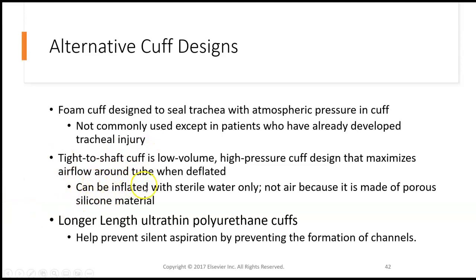These tight to shaft cuffs typically have to be inflated only with sterile water and not air, because otherwise the material is a little bit permeable to the air and will leak and gradually deflate over time.